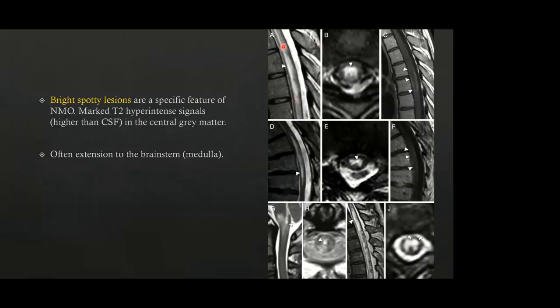On sagittal sequences, long-segment myelopathy involving the thoracic cord can be seen, with minimal or vague enhancement on post-contrast images. On another image, involvement of the brainstem and cervical medullary junction is demonstrated.